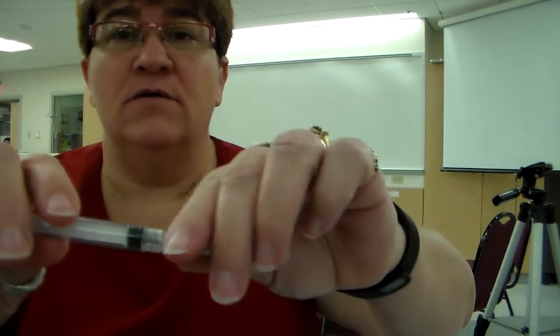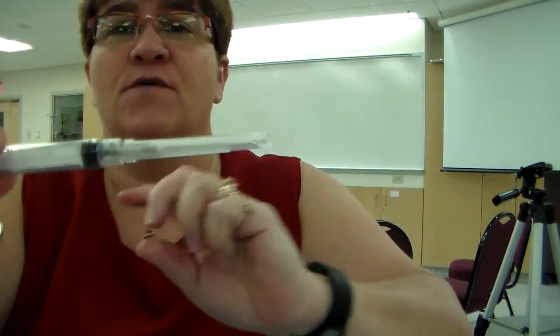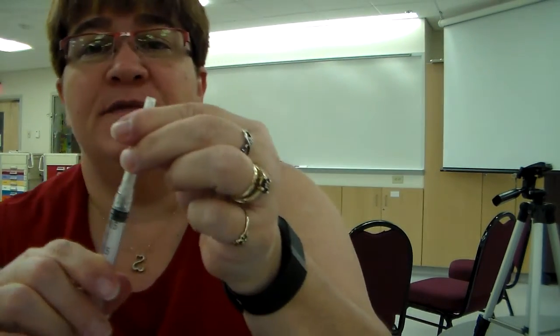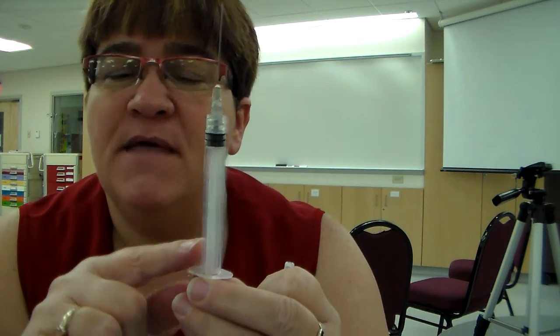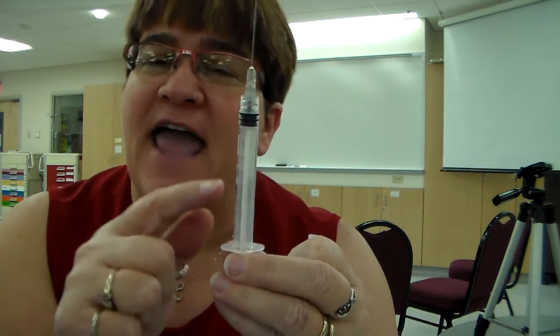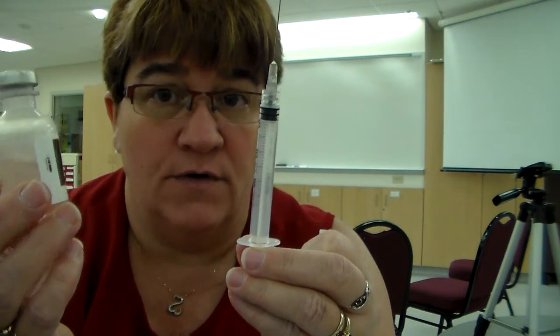You're going to get your needle. Make sure that the needle is firmly on your syringe. When I just picked that up, that needle wasn't firmly on. It was just kind of sitting on there. So I'm going to turn it and make sure it's firmly on my syringe. Then you're going to remove the cap from the needle, and you're going to draw back on the syringe the amount of milliliters that you're going to take out for medication. So you want to instill air into this syringe, the amount of medication that you're going to take out of the vial. For this, we're going to do a whole 3 milliliters.